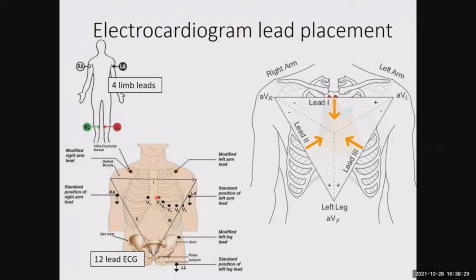Now, in general, even though we're using a 12-lead ECG in a clinical setting, they're basically comparing 3 leads at a time, measuring changes in the voltage differential and the direction of those voltage changes in relationship to the body, using these different leads.